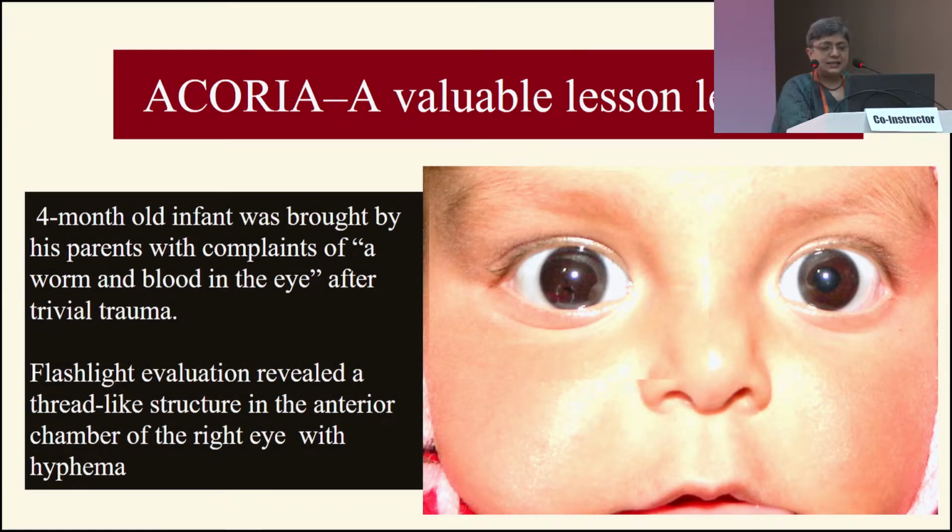So I'll just take you through a valuable lesson learned. Interesting, we learn every day. This baby came to us with a history of trauma, and there was this worm-like thing, and the mother was distraught, saying a worm had got into the eye. There was hyphema. This was funny because the other eye looked completely normal, and we said, okay, let's take it up. And for some reason, I said, let me look beneath the iris and see what's there.